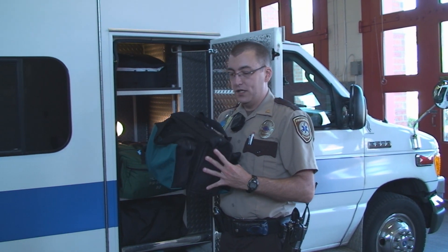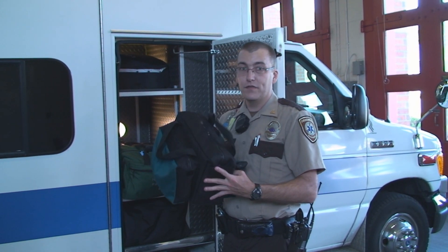This is our OB bag. This is for delivering babies or assisting in the delivery of babies in the field.